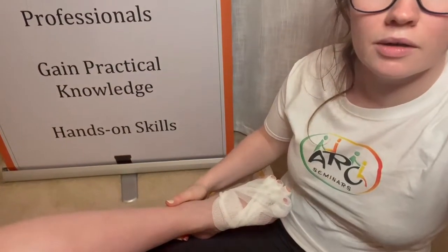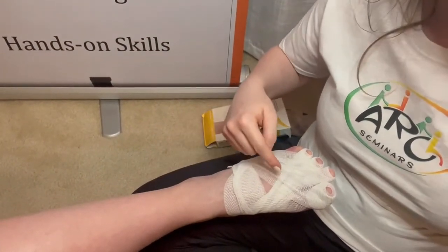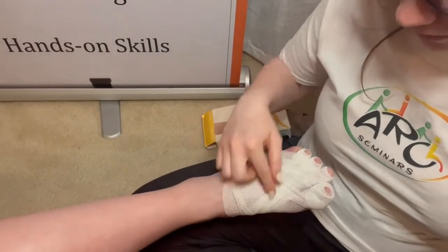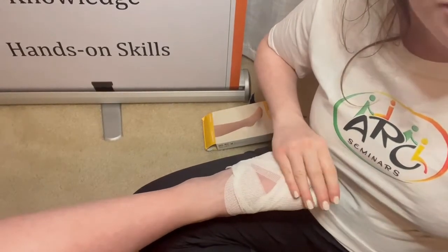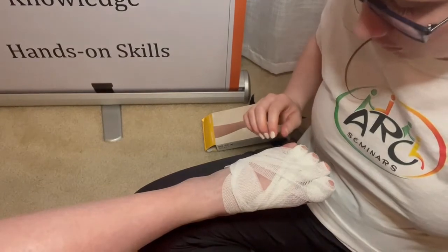As you can see here, the finished toe wrap should look like this. Diagonally across with the very tips of the toes out, and the toes should be able to move, should feel warm, shouldn't feel as if circulation has been cut off.